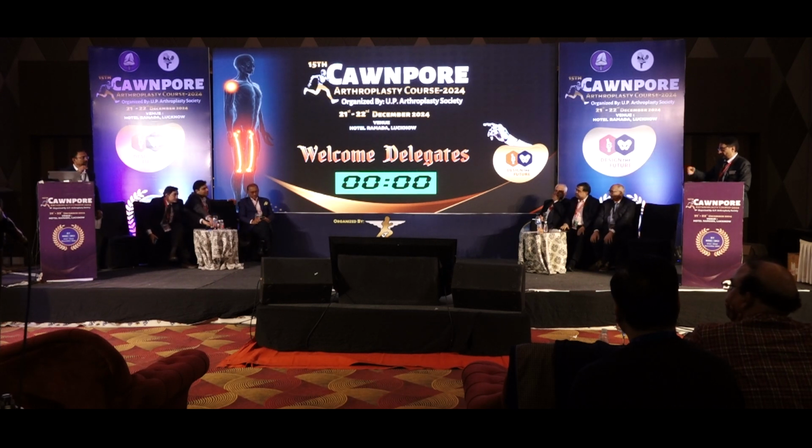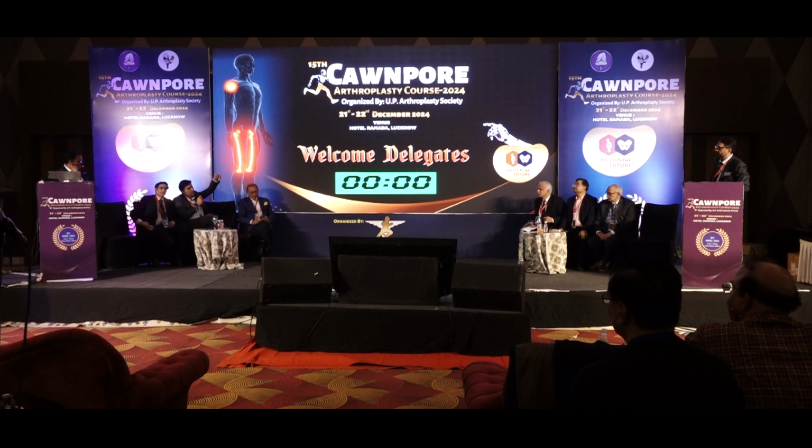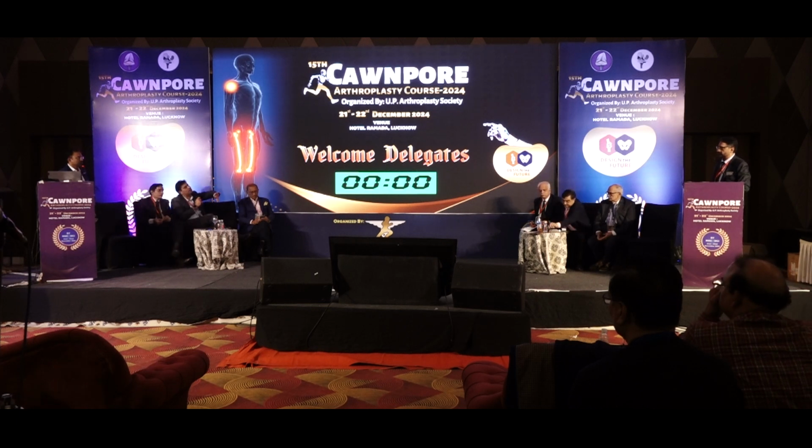I would suggest you try the IM jig in spite of the difference in your cases. The earlier versions of bicruciate knees failed because they had a very poor keel. Now recently, I think Smith & Nephew has come up with a knee that has a reasonable flat keel, very similar to Triathlon. And this one is doing good in the primary studies.